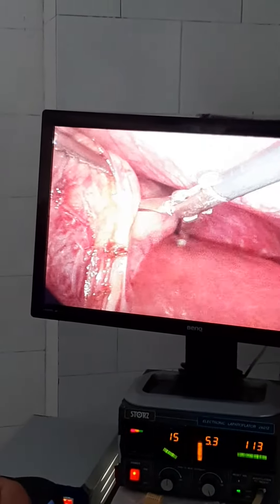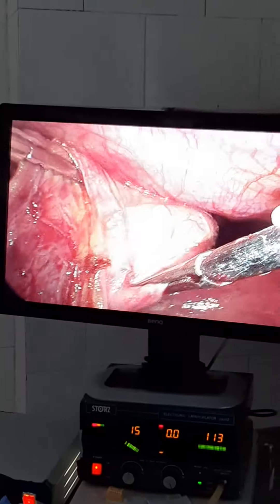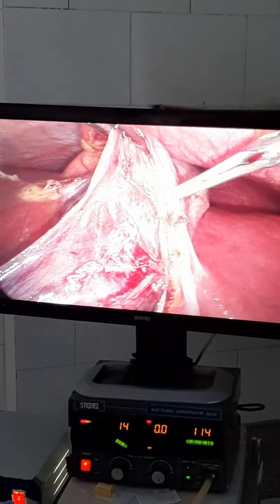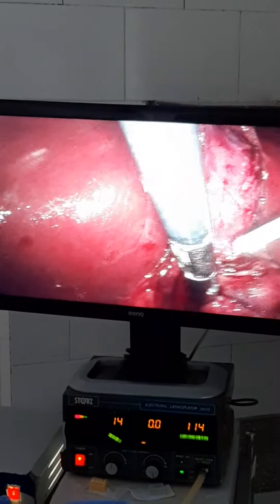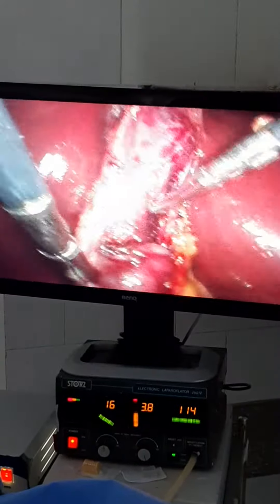This is a very long gallbladder, as you see here. This is the fundus of the gallbladder here, and this is the body of the gallbladder extending here. This is Hartmann's pouch. Hartmann's pouch was like this, and this was the end of the gallbladder.